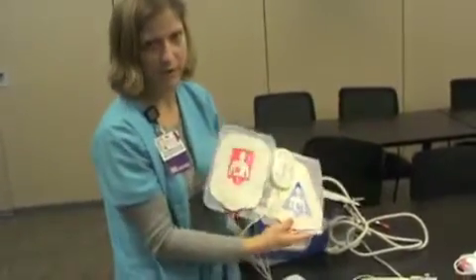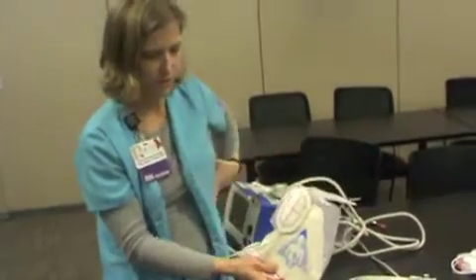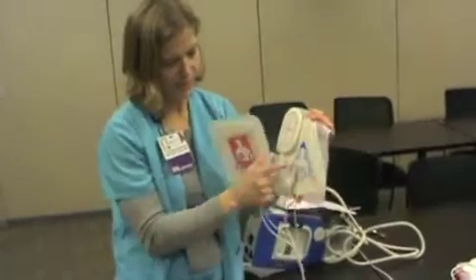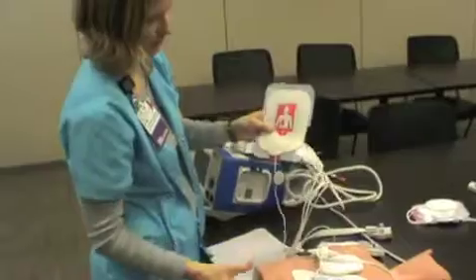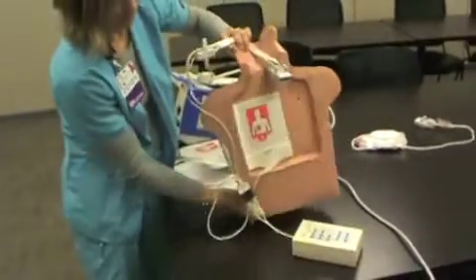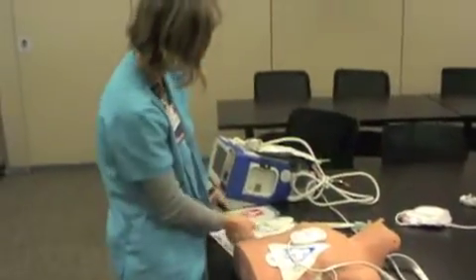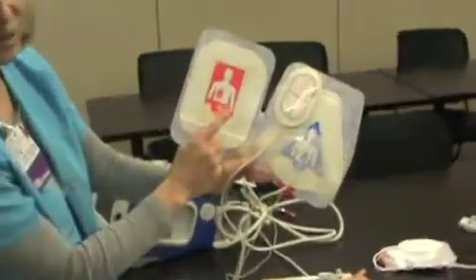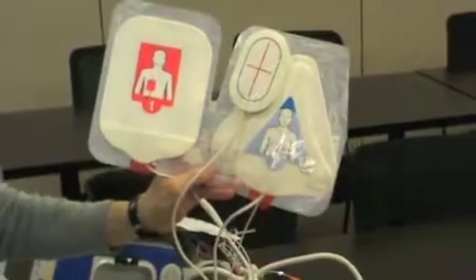So the placement of these pads is important because instead of both going on the front of the chest, Zoll recommends this triangle pad to be placed on the front and the other rectangular pad to go on the back. So like they've done on this mannequin. Anterior, posterior placement. It tells you right here on the pads to place this one first. So put the one on the back first, and then the one on the front second.